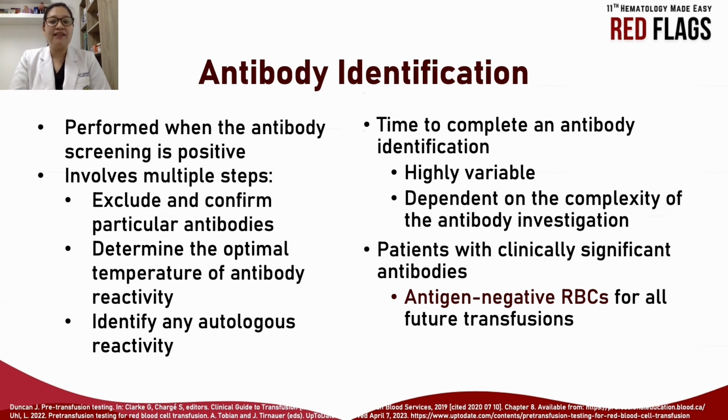The time to complete an antibody identification is highly variable and is dependent on the complexity of the antibody investigation required. Patients found to have clinically significant antibodies should be restricted to antigen-negative RBCs for all future transfusions, even if the antibodies are not apparent on subsequent routine testing.